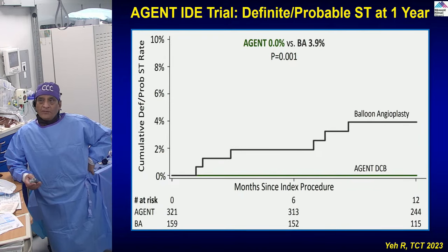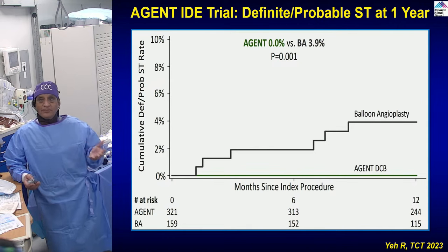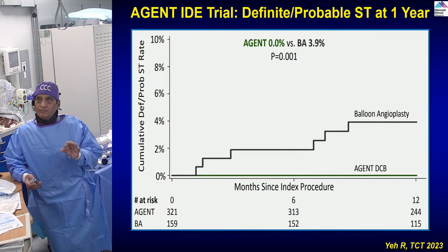And more importantly, which I always showed, the drug-coated balloon will not have stent thrombosis because there is no stent. And exactly that is what we saw: 0 stent thrombosis compared to 3.9% in the balloon angioplasty group.